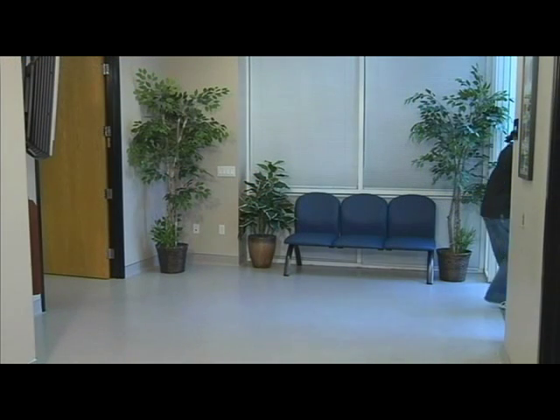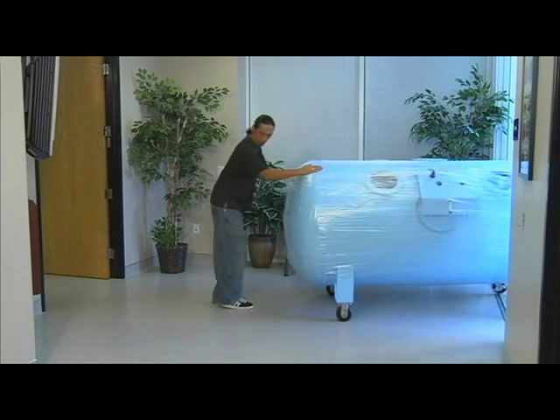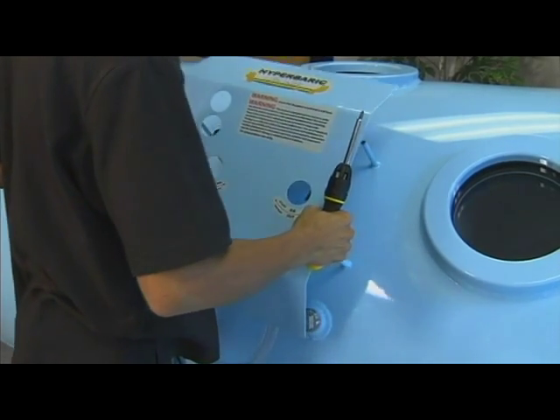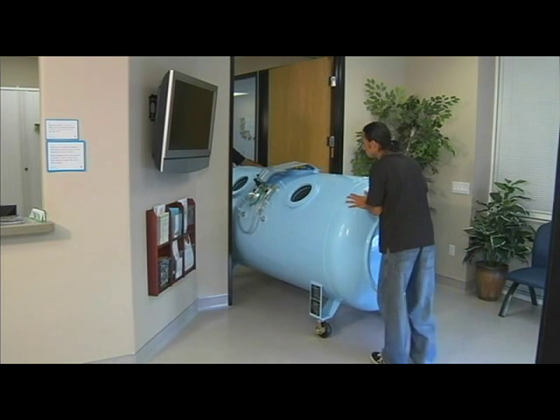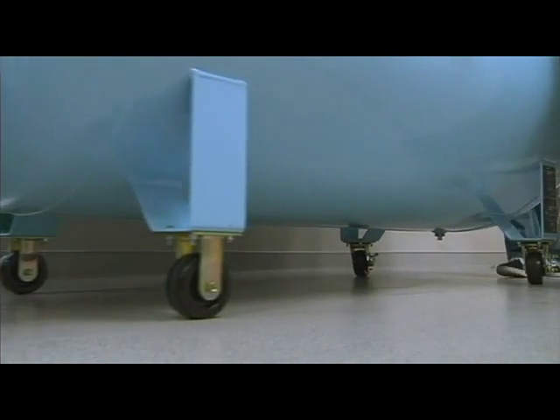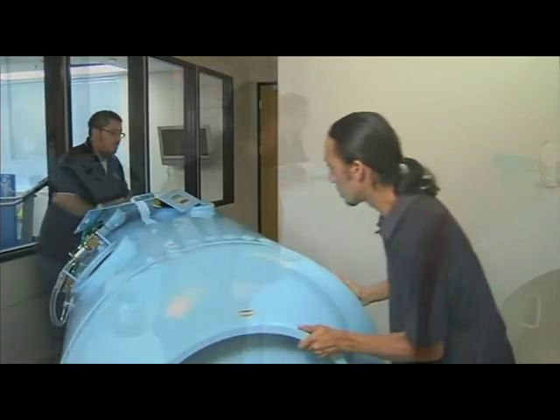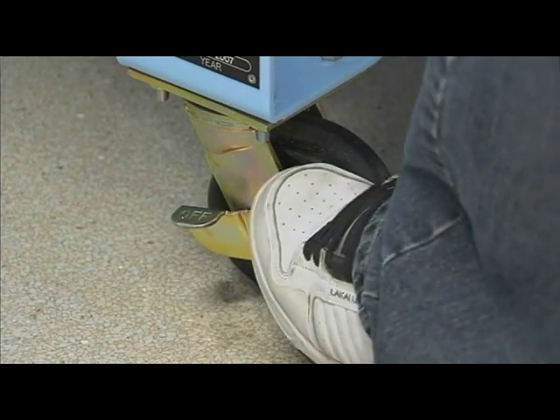The 40s 420 chamber is specifically designed to fit through a commercial 48-inch doorway. For offices with narrower doorways, OxyHealth will work with a professional contractor of your choice to expand the doorway for the chamber installation and then reinstall everything exactly as it was. The short wheelbase and permanently installed casters make the 40s easy to maneuver down hallways and around corners. Once in place, the wheels are locked for added stability.